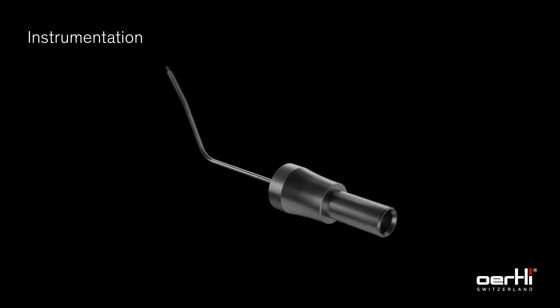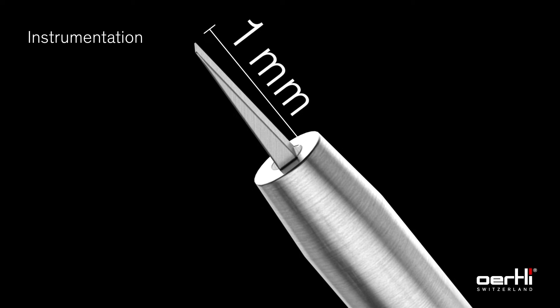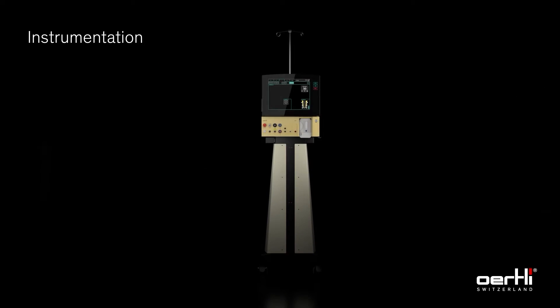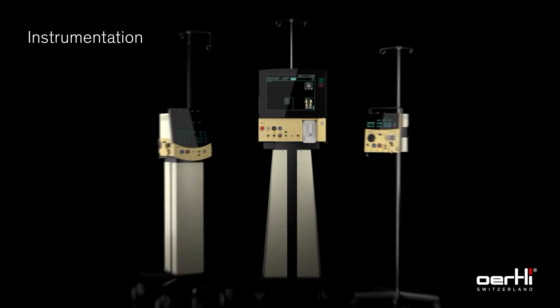The Eertli diathermy handpiece, together with the specially formed HFDS tip, is connected to the Eertli surgery platform. HFDS can be performed with every Eertli surgery platform.